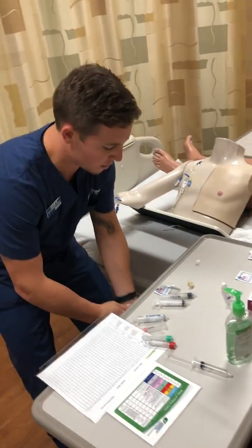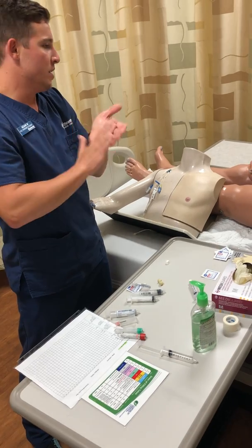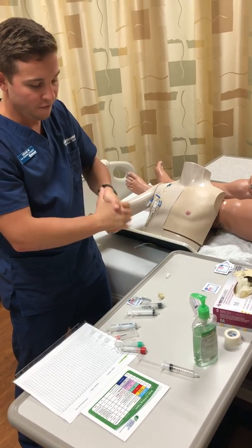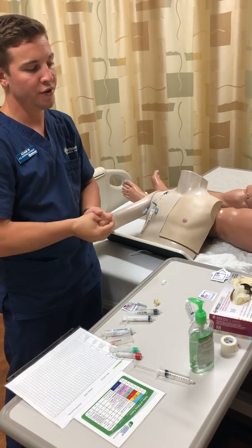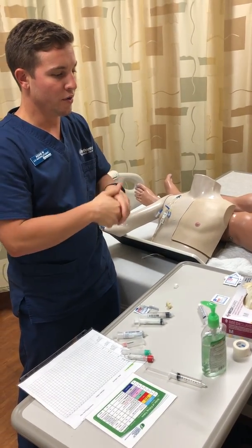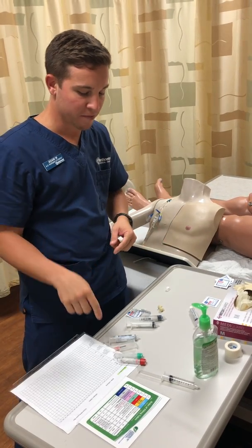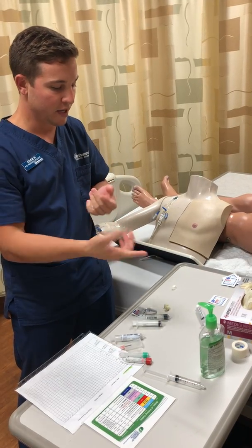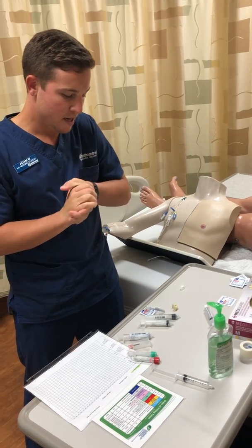I'll take off my gloves, clean my hands, and check in with my patient to see how she's doing. Jennifer's doing great, she says. We're going to ensure safety: low bed, floor mat, call light within reach, and arm rails up. I'm going to clean up my area and dispose of my sharps inside the sharps container. The syringe that we used earlier with blood, you'd want to throw in there as well.